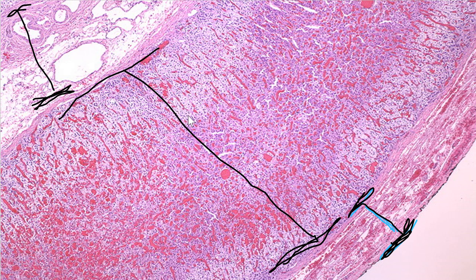Now, when trying to figure out the regions in the cortex, the biggest thing that's going to help you here, and a lot of people struggled with this slide. I remember from tutoring, helping people look at this slide or seeing them look at the adrenal gland, this really took people off the rocker. Like, how am I going to remember this? I don't see this at all. What you need to look for is the color differences, okay?